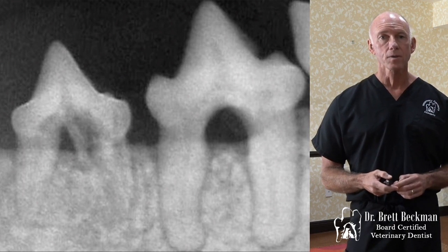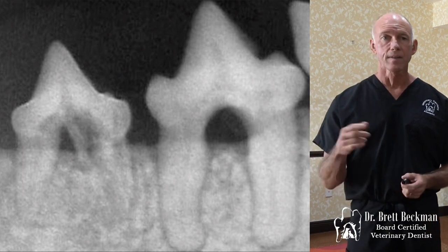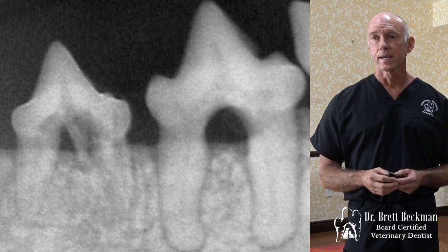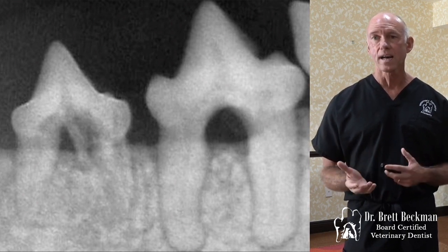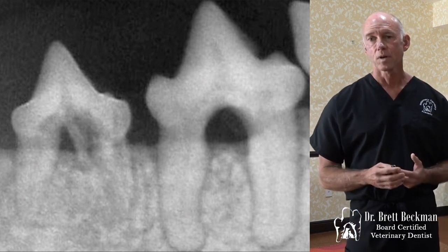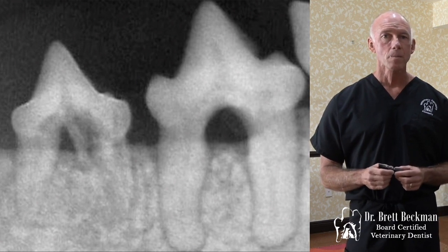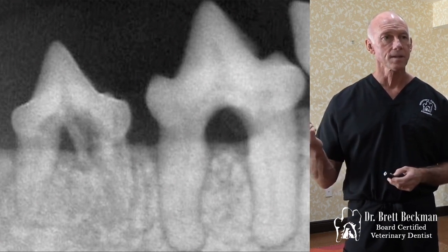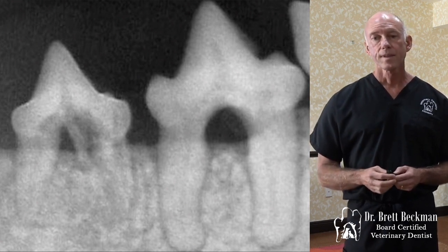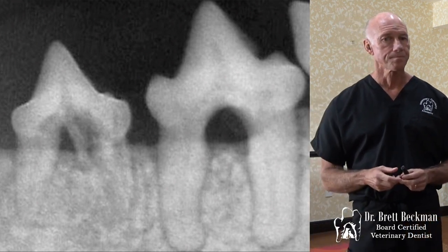There's no way to alter the progression of that unless we do an apically positioned flap like we did on that canine tooth and take all that tissue out and knock the bone down and have the owner come back to save that tooth, which is not really a significant tooth. So owners are not going to do that for the most part. And I agree with them. I don't think it's worth putting the patient under anesthesia every 6 months to maintain something like that for a tooth that's not a critical tooth. So that one, the 08, is a perio case, that one's an extraction.